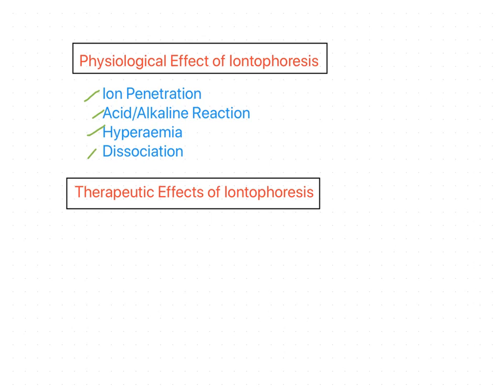The bulk of the ions deposited are found directly at the site of the active electrode, where they are stored either as a soluble or insoluble compound to be depleted by the sweep of the circulating blood and/or utilized locally as a concentrated source for further recombinations. This is about the ion penetration.